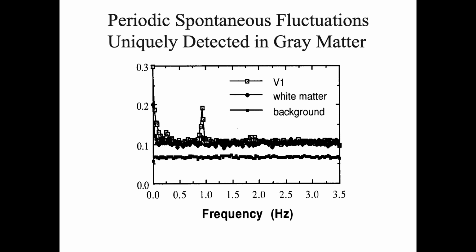As a student, my focus was to look at the noise characteristics in the brain, and we studied noise characteristics from 3 different regions. The bottom line is noise characteristics from a voxel outside the brain. As expected, the noise is smaller compared to physiological noise. The white matter noise is significantly less compared with gray matter. For gray matter, we observe the cardiac signal at 1 Hz and its harmonic at 2. We can also see the respiration signal. We can also observe this low frequency signal.